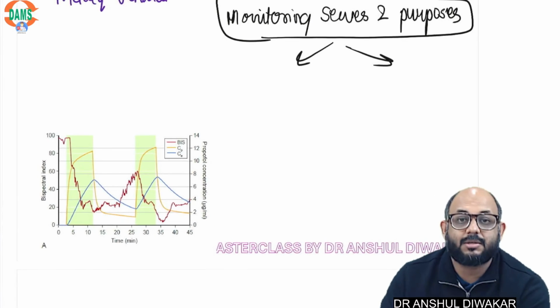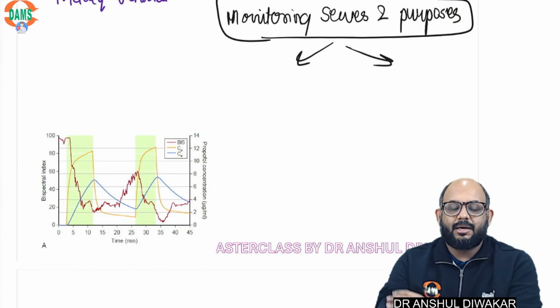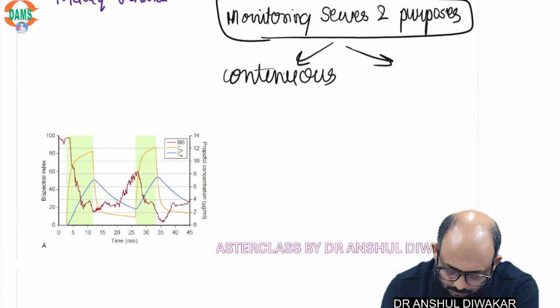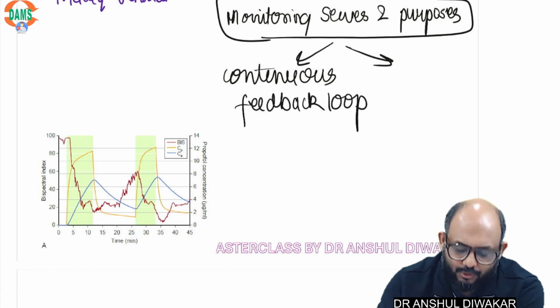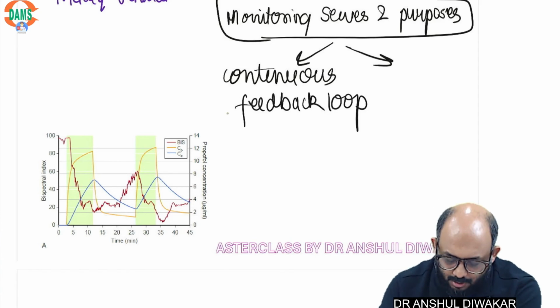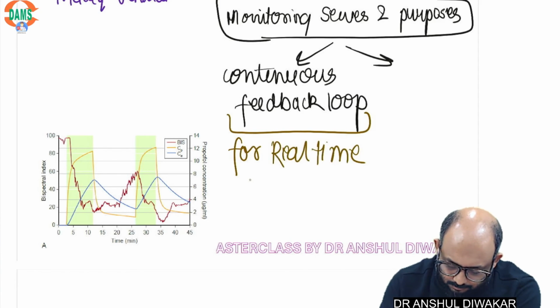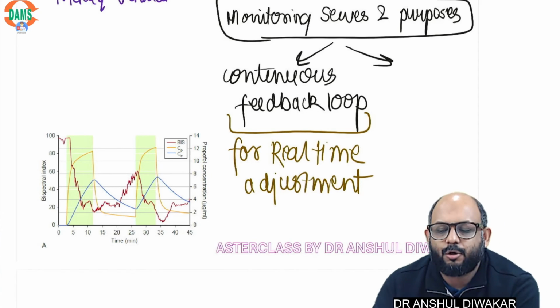First is that it gives you this continuous feedback loop for real-time adjustment of the dosing.